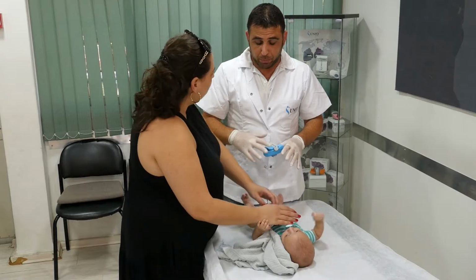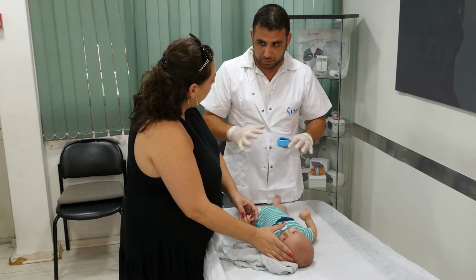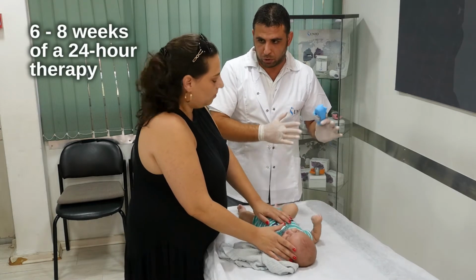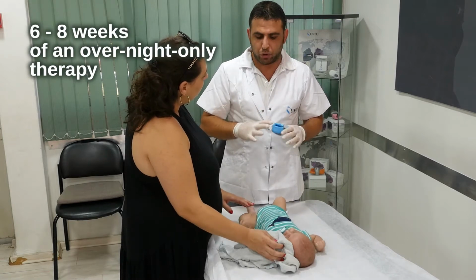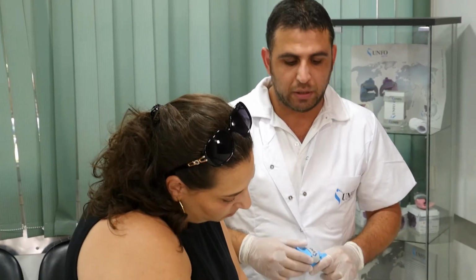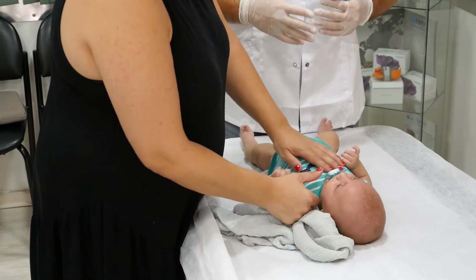Before setup, explain to the parents that the therapy is not painful for the baby and that the average therapy duration is between 6 to 8 weeks of a 24-hour therapy, and then an additional 6 to 8 weeks of an overnight-only therapy. The therapist is the only person to determine therapy duration according to the severity of the case and the progress made during the therapy.